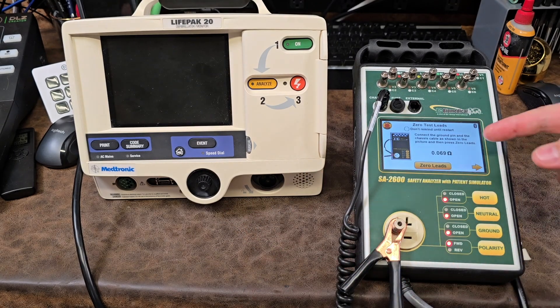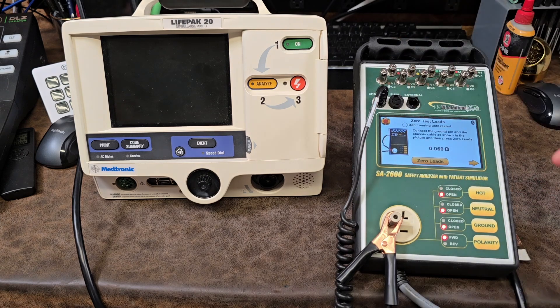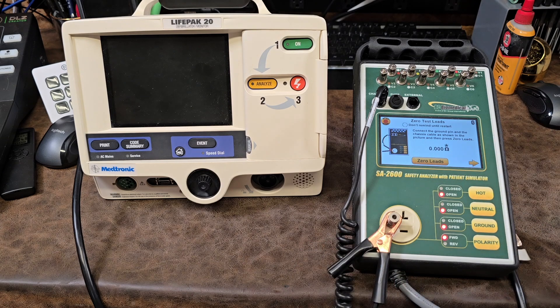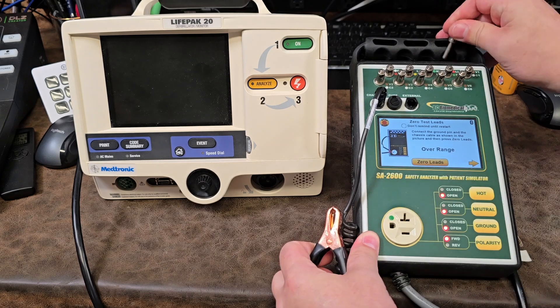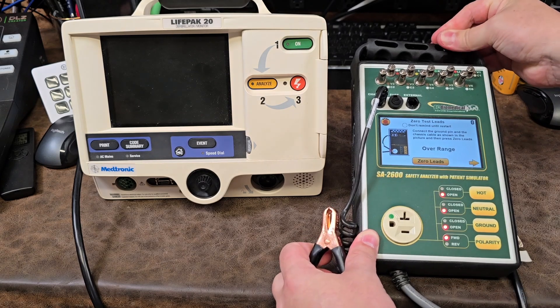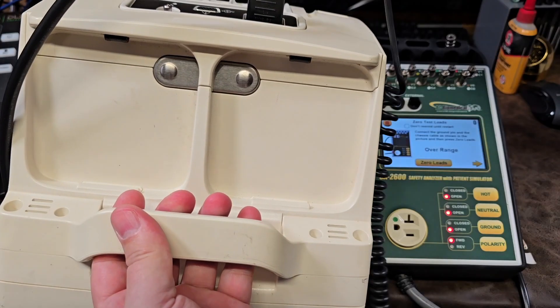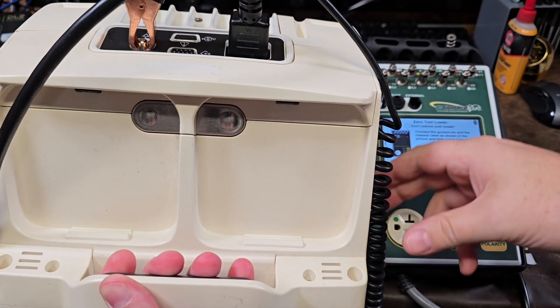Zeroing is a pretty important step because your leads have an inherent amount of resistance. As soon as I click it up it will show you whether or not this lead is good or bad. You can see it's pretty stable, so we're going to go ahead and zero the leads. Now we disconnect the clamp, stow the banana plug, and connect our device to the grounding lug on the back of the device.